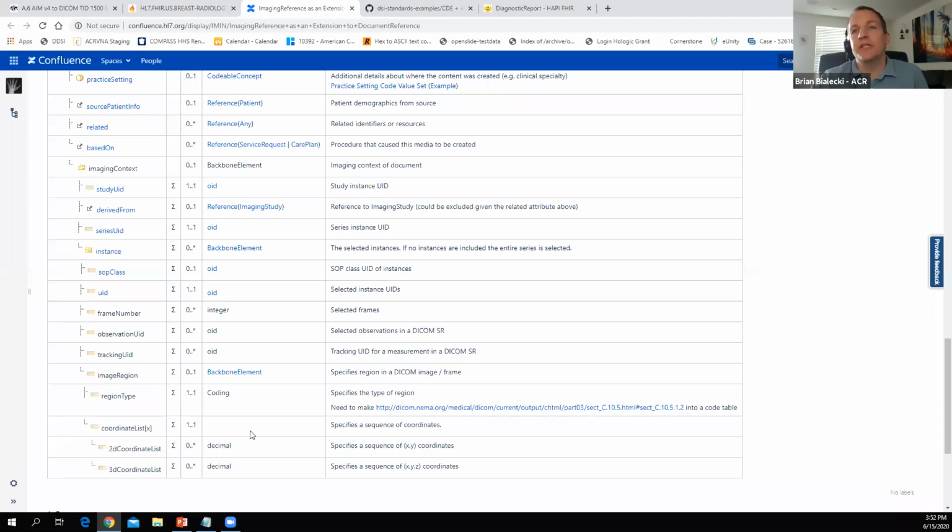And I do understand that, but from what I have found from GSPS, I wouldn't be able to do that. That's why we wanted to go down and be much more specific and point to a particular line. I didn't want to use a CAD SR where it's basically an overlay to an image, or a secondary capture image where I just have basically a screenshot, because there could be multiple items on it, and it's very difficult to figure out.